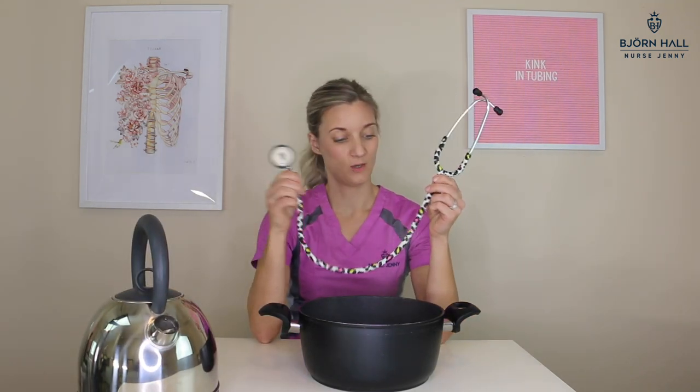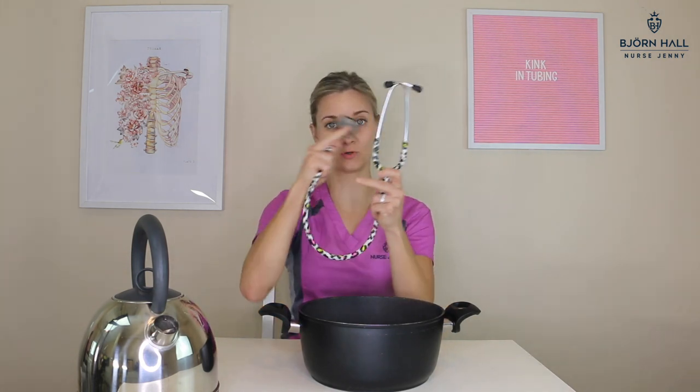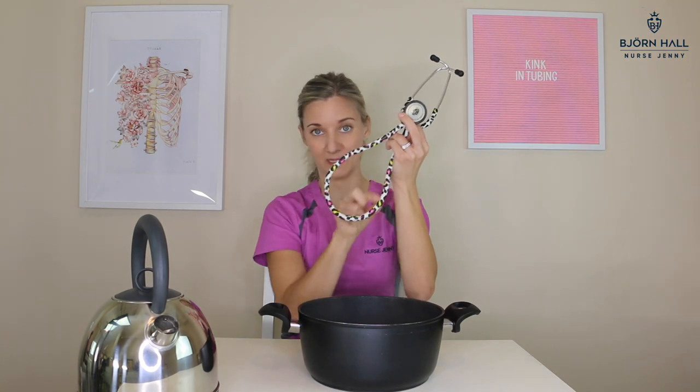Step two: submerge the stethoscope — only the tubing, not the chest piece or the binaurals, only the tubing part that is kinked. Submerge it for 30 seconds and then watch the magic happen. I'm going to show you.